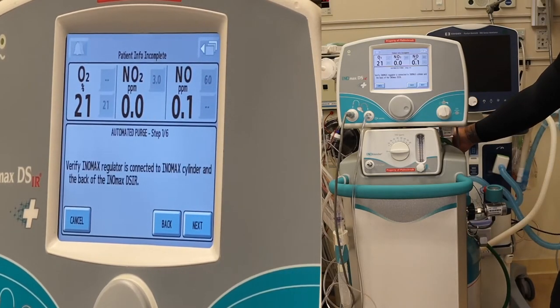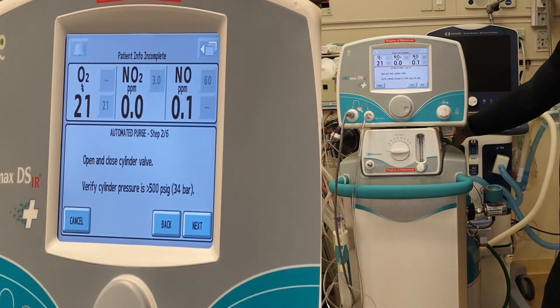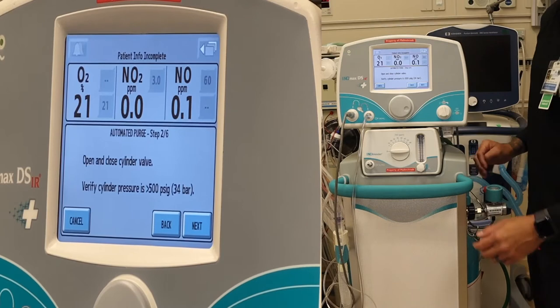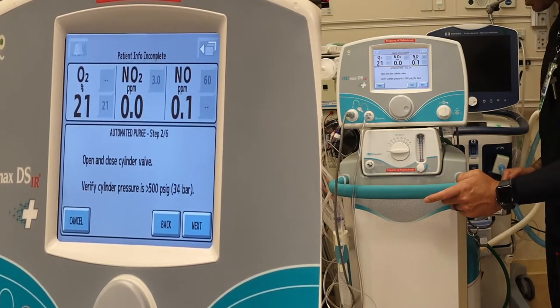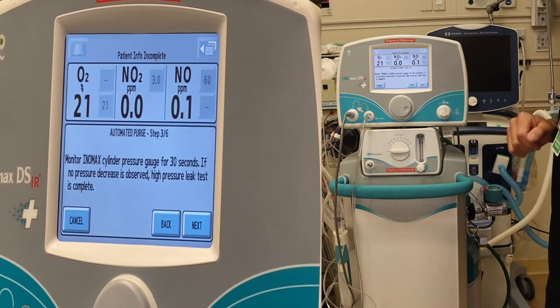The system is going to do an automatic purge. Verify the INO MAX regulator is connected to the INO MAX cylinder and the back of the INO MAX DSIR — done. Next, open the cylinder valve. Verify the cylinder pressure is greater than 500 psi. I'm looking at my pressure gauge — I have 750 psi. Press next.